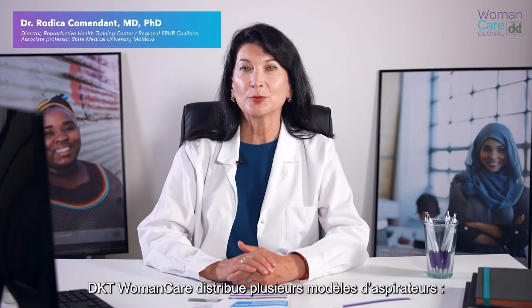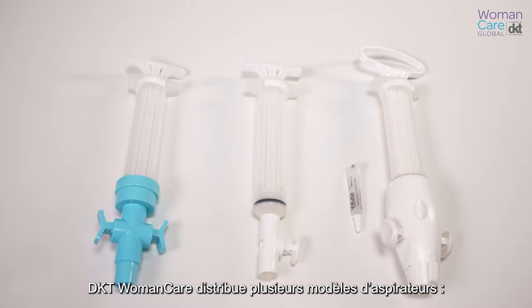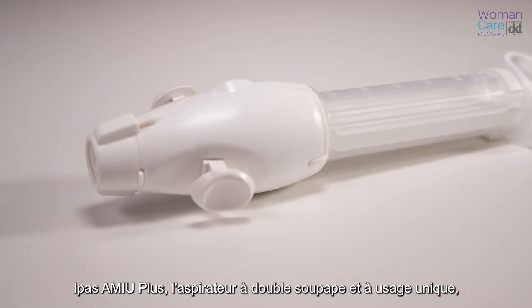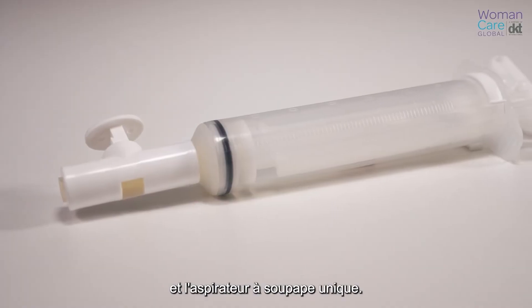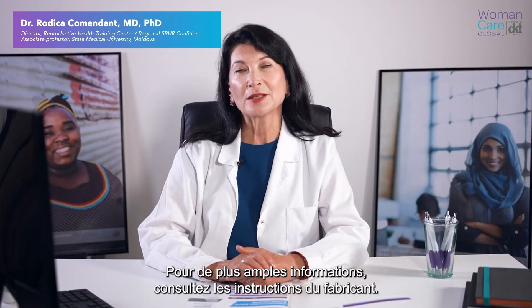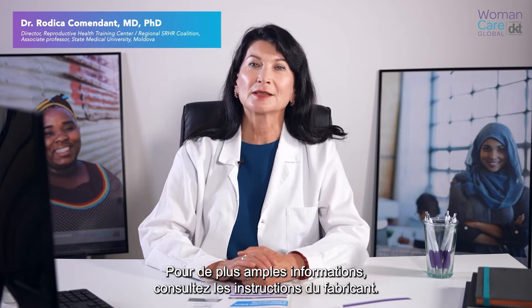DKT Women Care distributes different models of aspirators: the IPAS MVA+, the single-use double valve, and the single valve aspirator. For further information, please check the manufacturer's instructions.